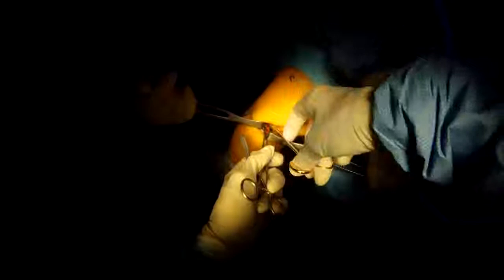Now I'm just going to cut it out with a pair of scissors. You can see I'm not using anything much more than an arthroscopic portal to do this. I'm just doing this under direct vision with retractors because it's quicker and easier than doing it arthroscopically.